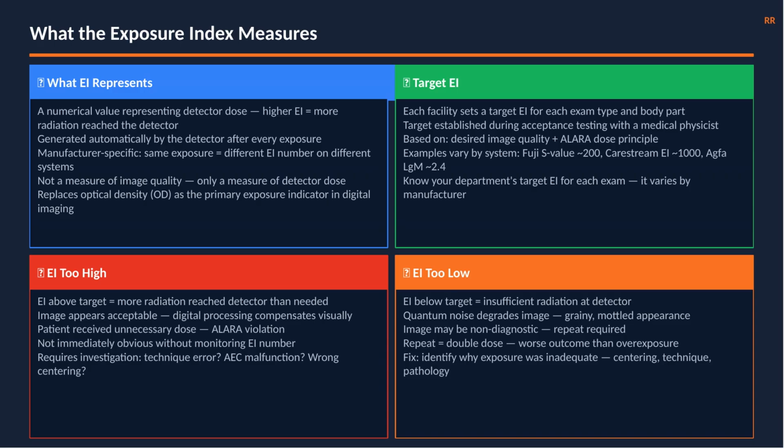Every facility sets a target EI for each exam type during acceptance testing with a medical physicist. Know your system's target values. Review the EI after every exposure. Make it a non-negotiable step in your workflow.